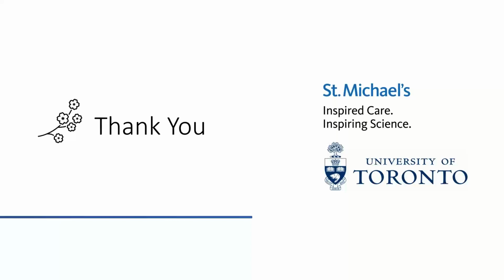Well, my understanding of how this works is that we would screen a patient. All of these patients need a TEE and a CT, and we send them to the company, and the company processes these images in their core lab and determines, based on the patient's anatomy, whether the patient is anatomically suitable for this procedure or not. A lot of the early feasibility studies are non-randomized, meaning that if a patient is accepted, they would get the device. After that, a date is set and the company would come. Typically, they plan 1 or 2 days of training for both the implanters and the imagers. They would go through, for example, a PowerPoint covering the important points and the important parameters that we have to look at echocardiographically during the procedure, before, during, and after.